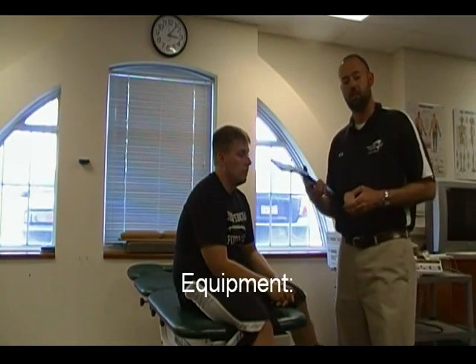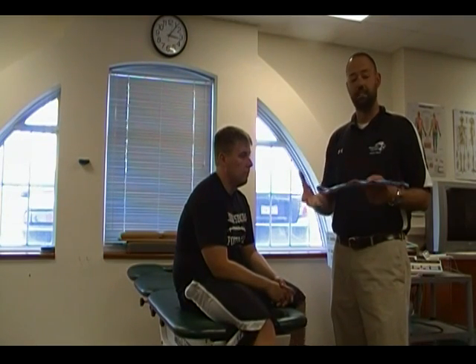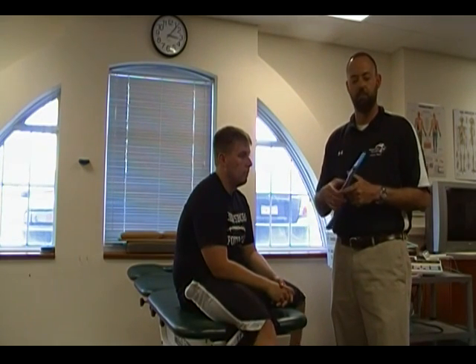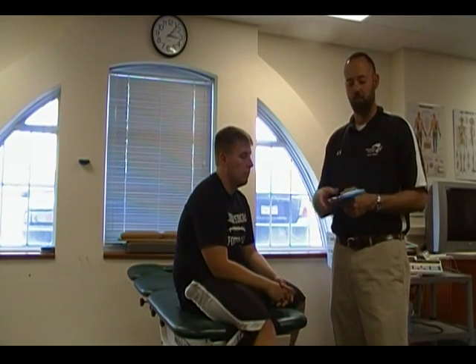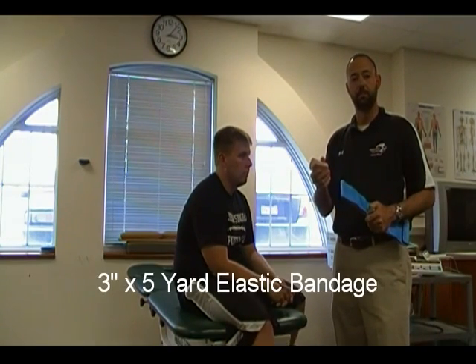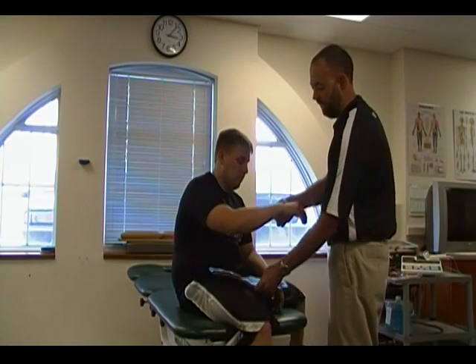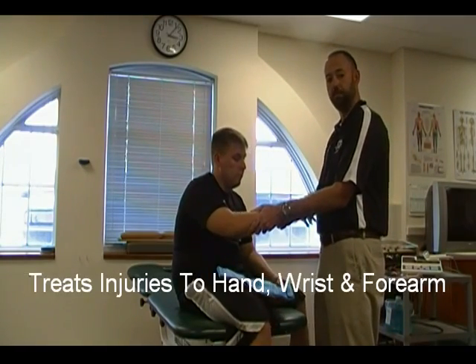Today we'll be using a SAM splint. This could be a rigid splint — you can use a board splint, or you could use magazines or any other materials in the event of an emergency — but today we're using a SAM splint, which is moldable and molds to the body. We'll also be using a three-inch elastic wrap. In this instance we'll be trying to splint injuries to the hand, the wrist, or the forearm.